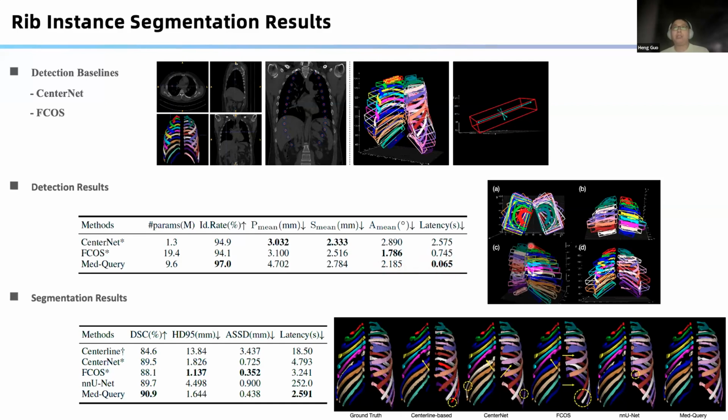In this detection visualization, we show normal results in superior to inferior view, a limited FOV case in posterior to anterior view, and a case with rib adhesions. And finally, all the odd number labels are queried, that is rib 1, rib 3, and rib 5, etc. Ground truth labels are rendered as a visual reference.